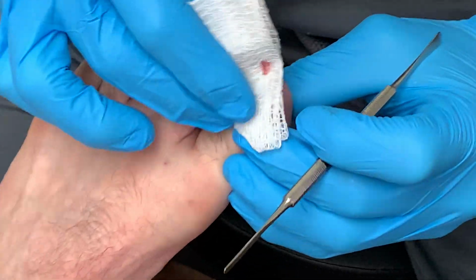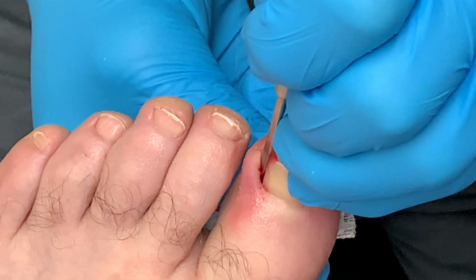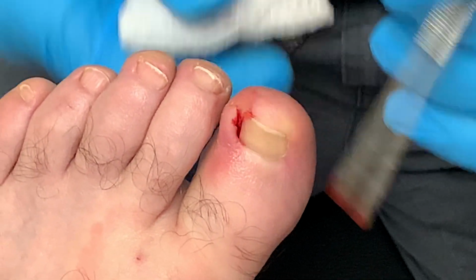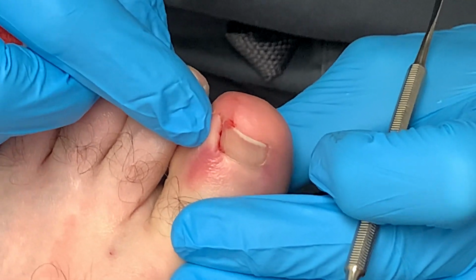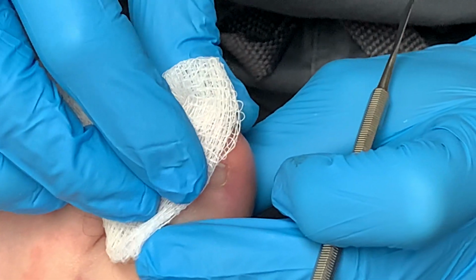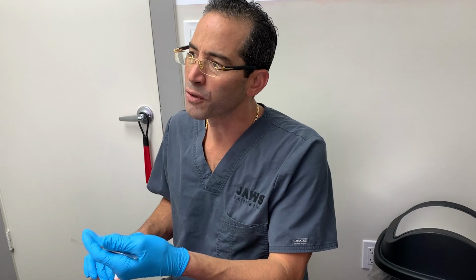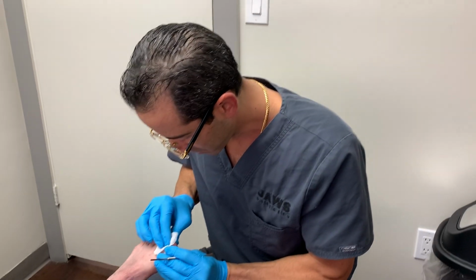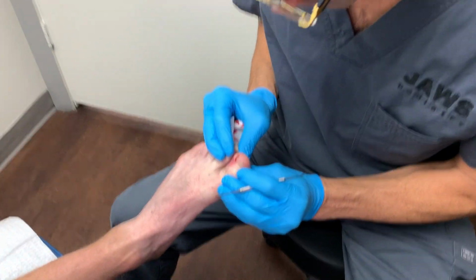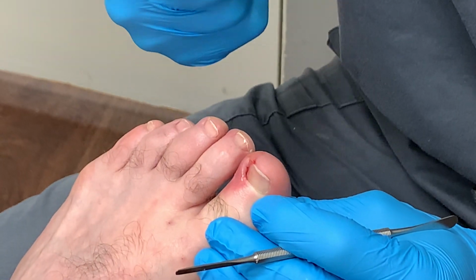So just to show everyone, what I'm doing now is making sure that there are no remaining nail spicules, none found. All of this puffiness is going to go away. See that? But looking at the nail plate, this is nothing acute. This is something chronic that has been there for a very long time. That proximal portion has just been there, and this is sort of the tipping point. The good news is this is going to contract like that. It'll look like that for a little bit, and then we'll see the new nail plate grow out. At that point, we can talk more about prevention techniques.